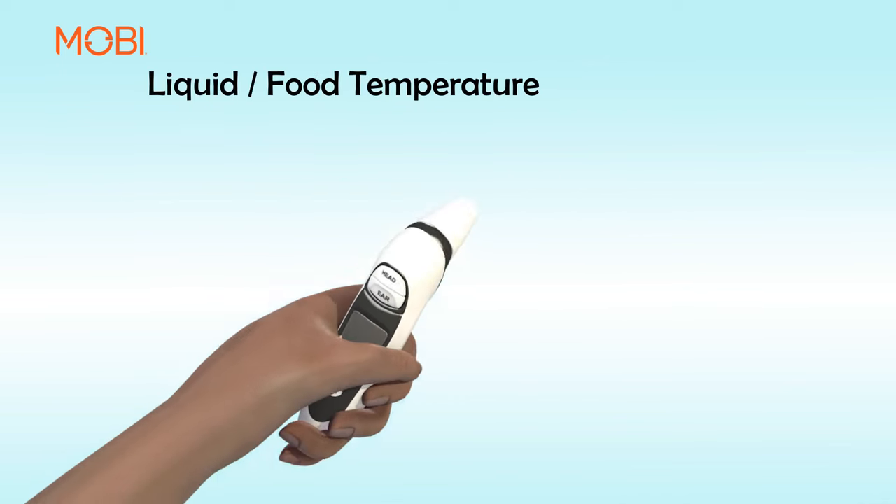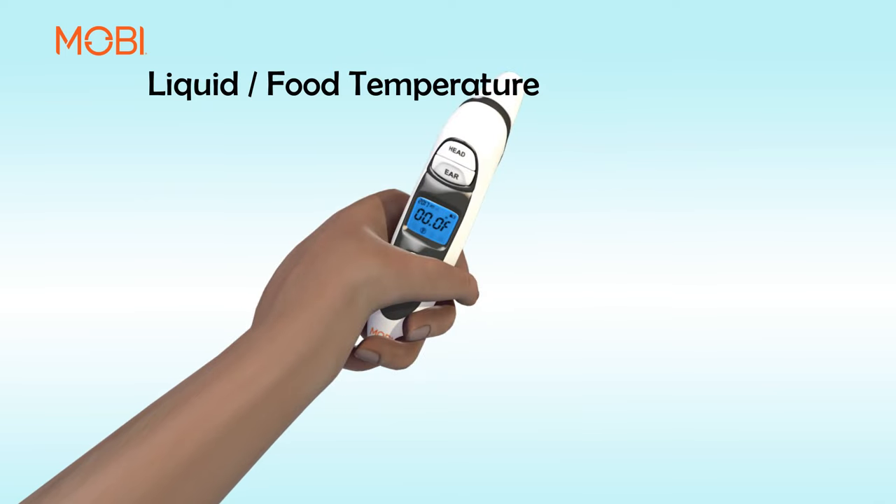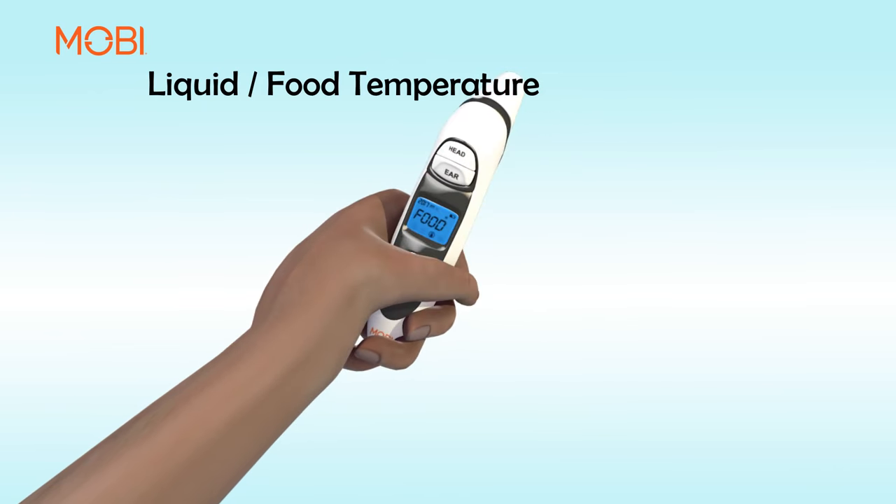Liquid Food Temperature. Press the head button to turn the thermometer on. Ensure that the thermometer is in food mode by pressing both the head and ear buttons once at the same time. Food will show up on the display.